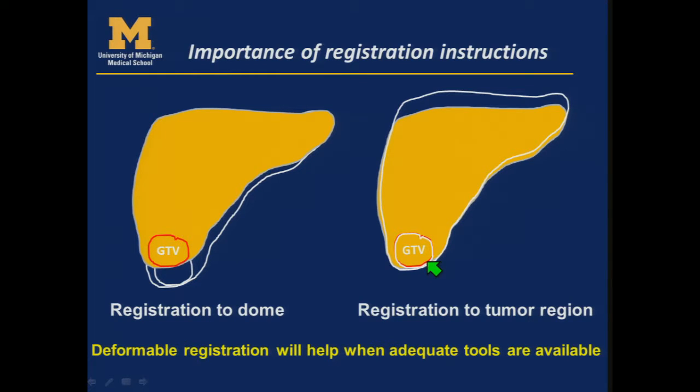In the future, once we have better deformable registration tools, this will not be necessary, but right now they're just not perfect.